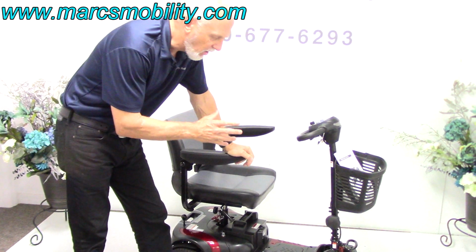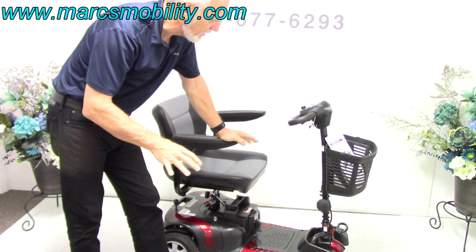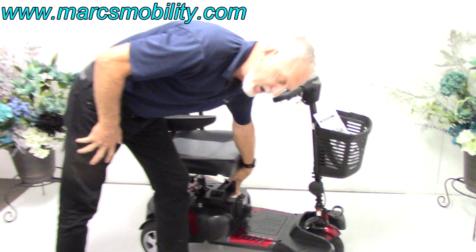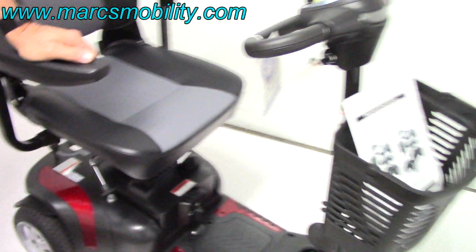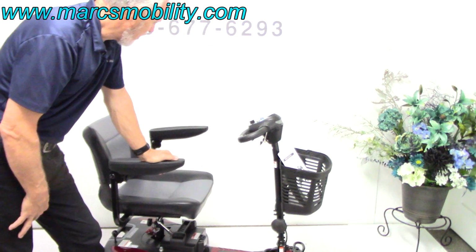One more thing about this scooter. If you have it in your car, and you just take the battery pack in the house, you don't have to take the scooter in, just take your whole battery pack. In the front of your battery pack where my finger is right there, you can also charge the batteries in your home. So take the battery pack in the house, and you can charge just the battery pack if you want to leave the rest of the scooter inside the car.